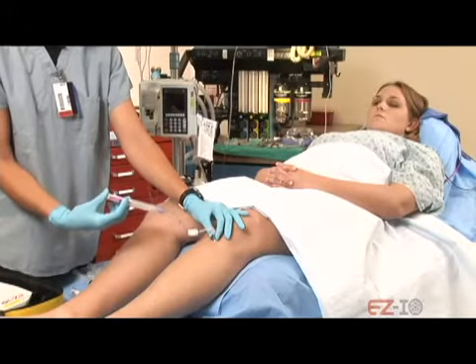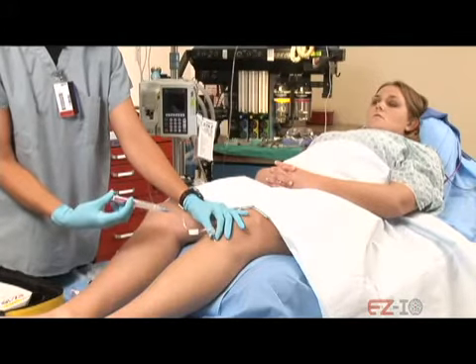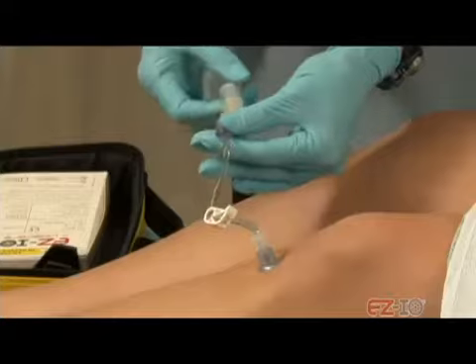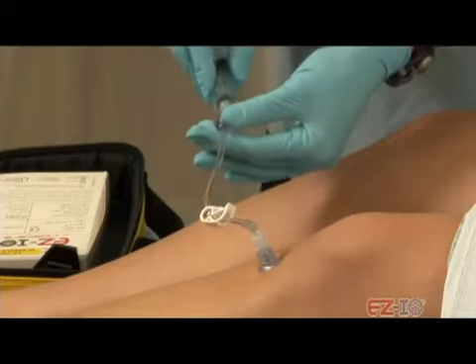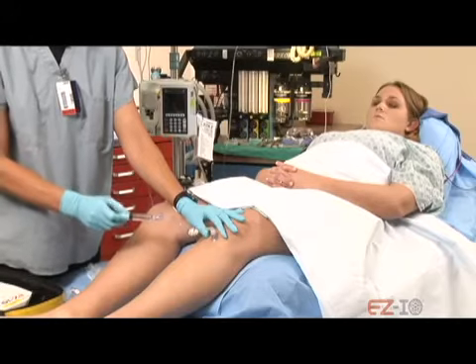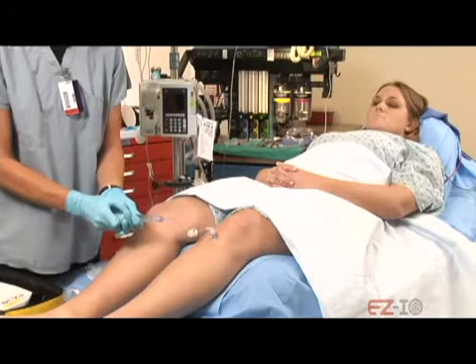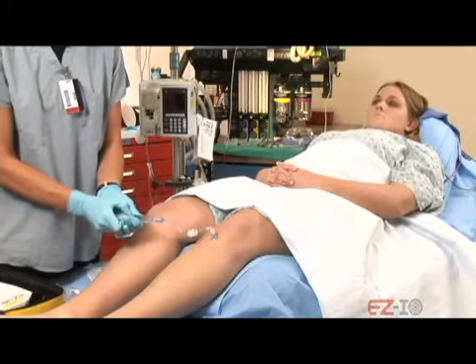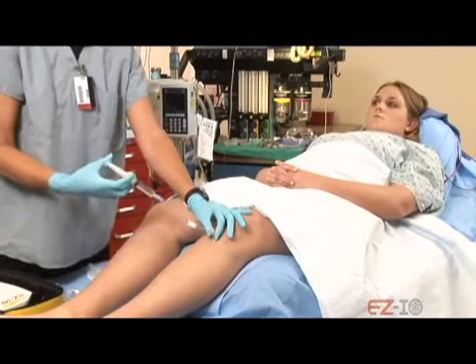And now? 3. Mm-hmm. Still doing okay? Mm-hmm. What's your pain level now? It's going down. 2. Okay. Now again, we're just going to go slowly here. Doing okay? Mm-hmm. Still doing okay? What's your pain level on a scale of 1 to 10? Like a 4. Okay. All right, now this next flush needs to go in pretty quick.